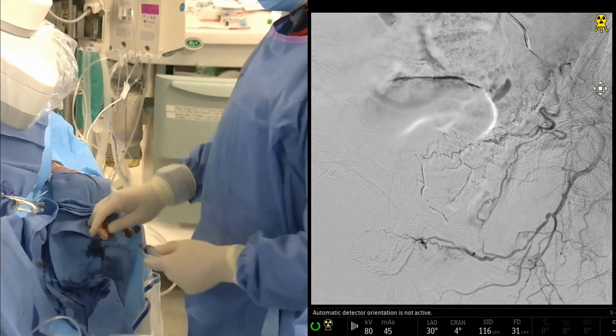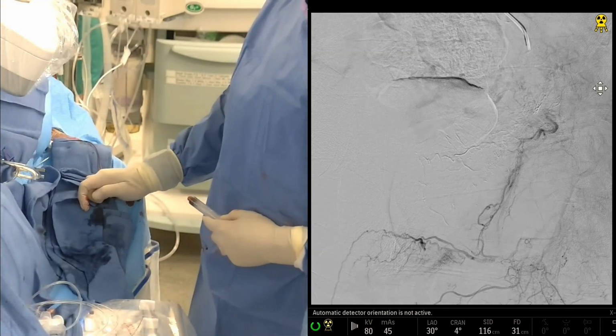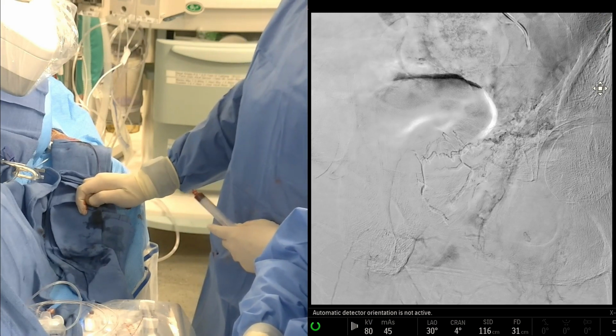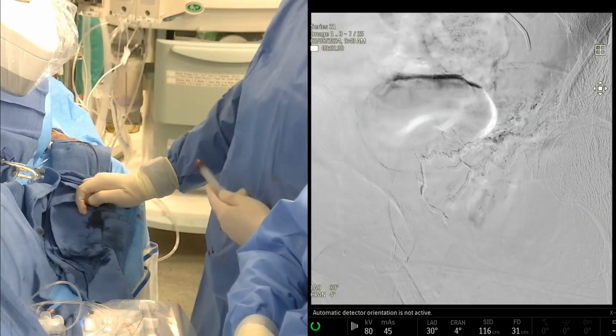And you see that rectal branch beautifully preserved. Yeah, and that's definitely rectal. I mean, if we were concerned, we could do a cone beam CT, but we know based on its anatomic appearance that that's a rectal branch.